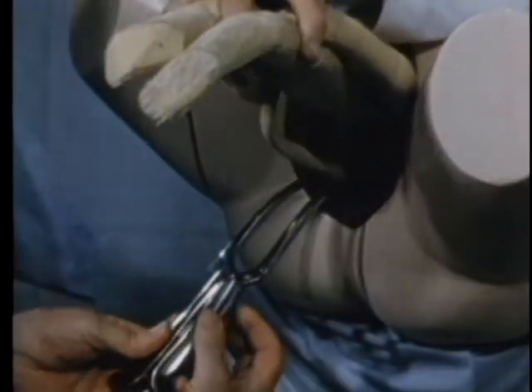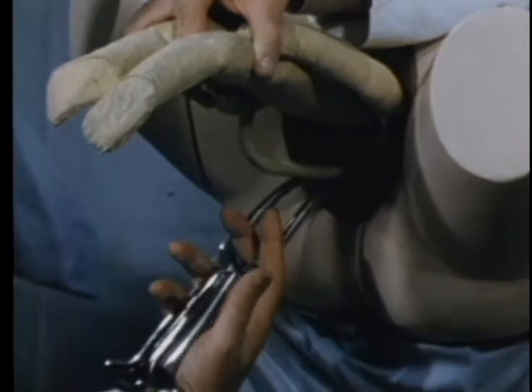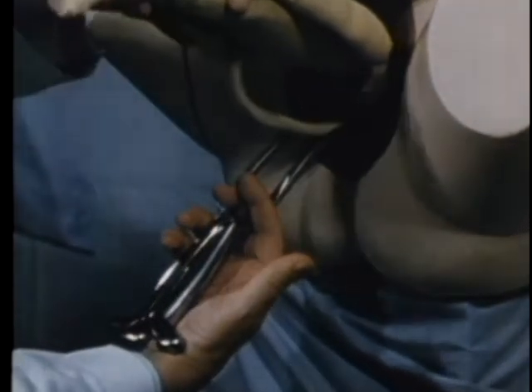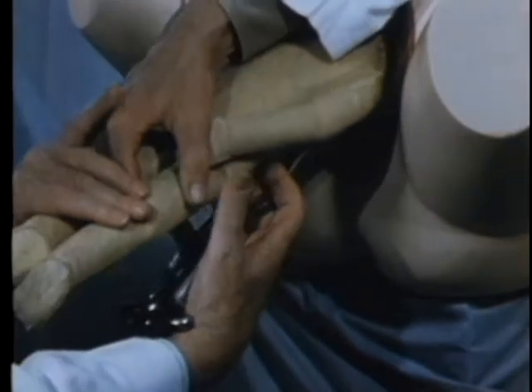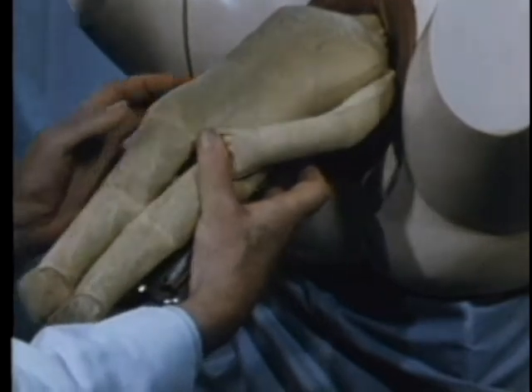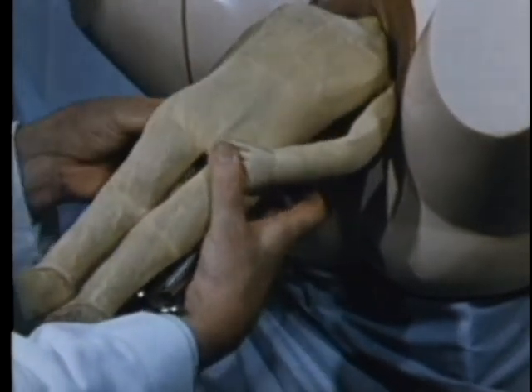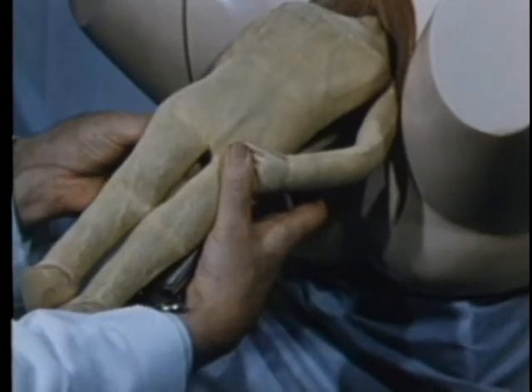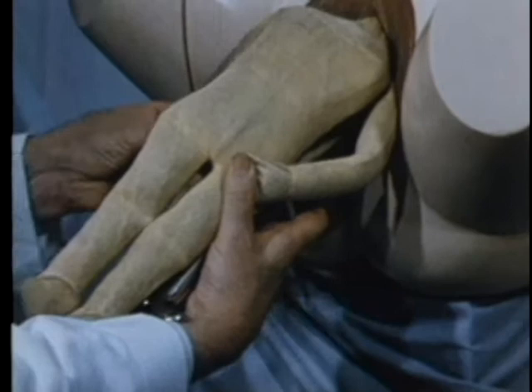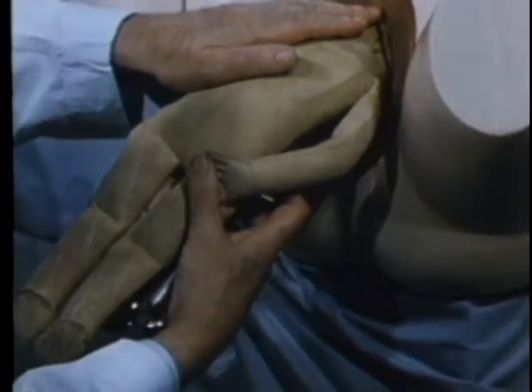Then the upturned palm of the right hand grasps the handles with the middle finger in the space between the shanks. The body is lowered, and the thigh is clamped to the handles by the thumb. And the hands are encircled by the thumb and the fingers to keep them out of the field of operation.